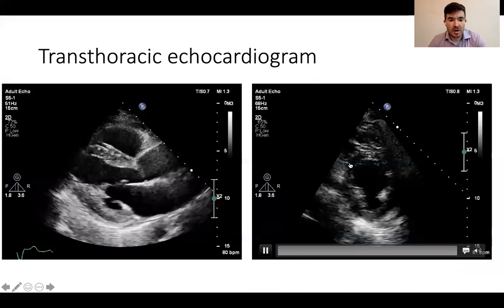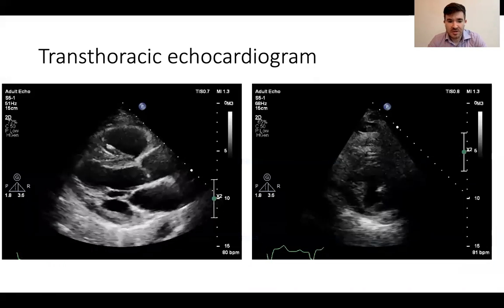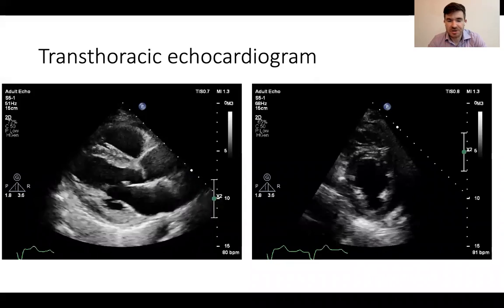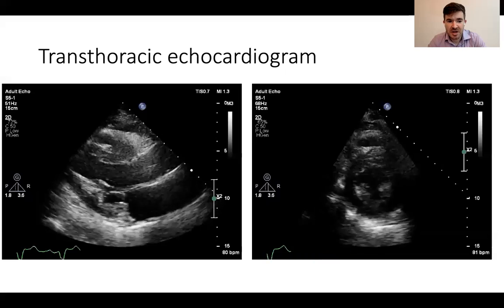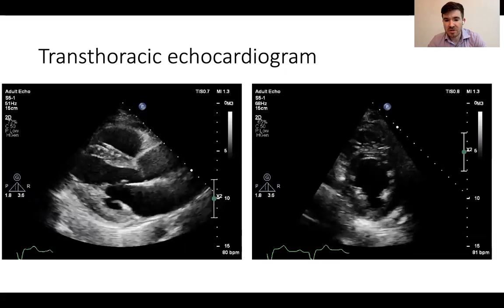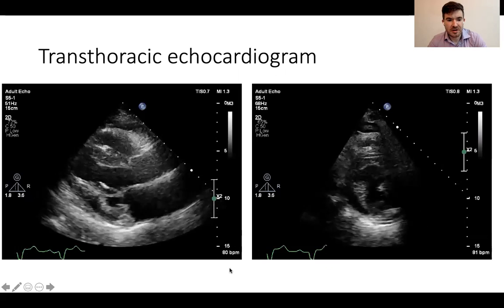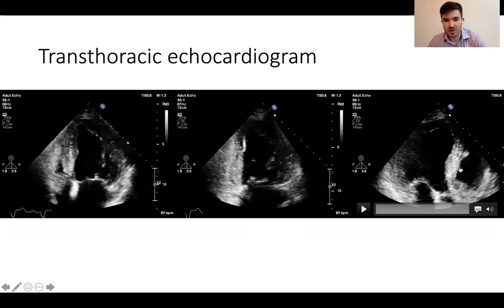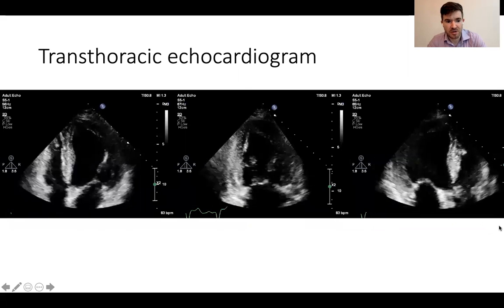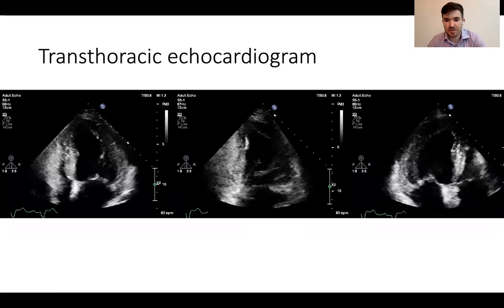Her echo again showed only mild to moderate LVH, which did have some suggestion of regional variation in the degree of LVH and near normal systolic function. No real convincing regional wall motion abnormalities, although it was a bit more difficult to appreciate whether there were some septal abnormalities in the context of her left bundle branch block.